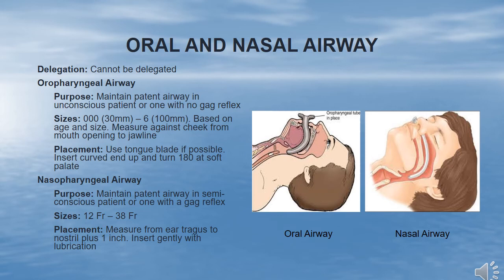Sometimes patients cannot keep their airway open or patent. This may be due to effects of medications like sedatives or from a semi or unconscious state. The insertion of oral or nasal airways cannot be delegated.